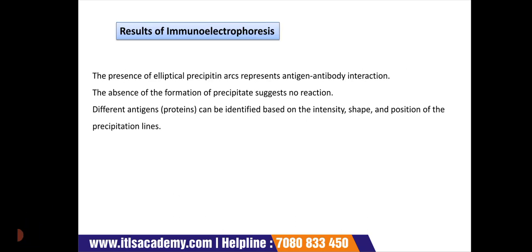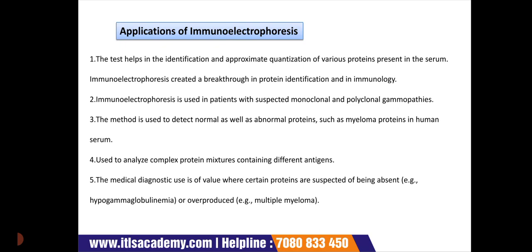Then the result of immunoelectrophoresis, and how it is identified: on the basis of intensity, shape, position and precipitation line. At last we discussed the applications of immunoelectrophoresis, where and how they are used.